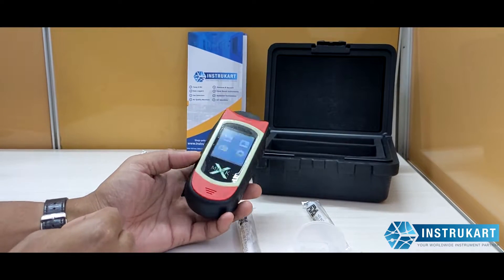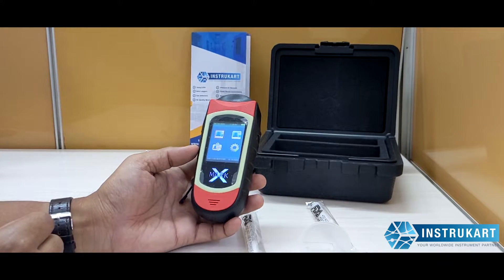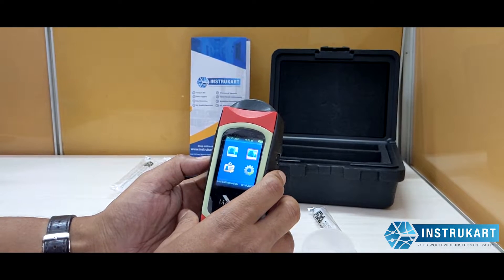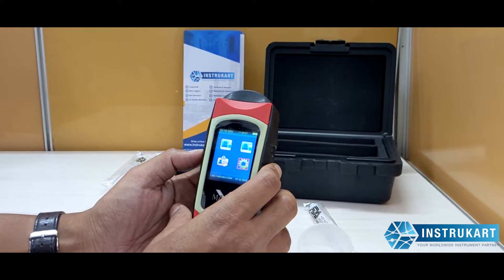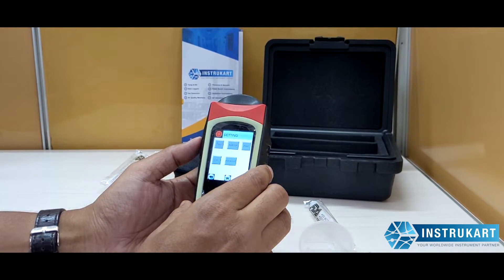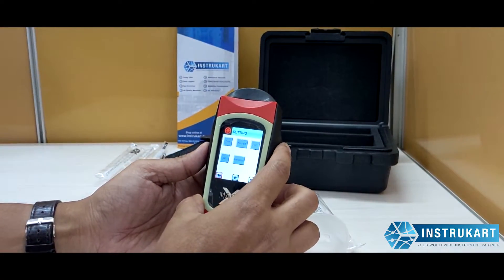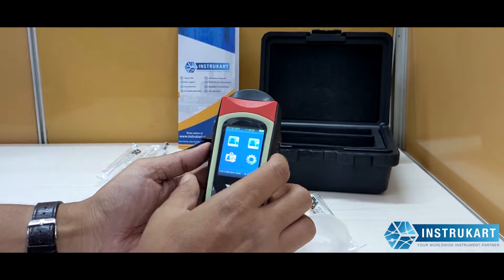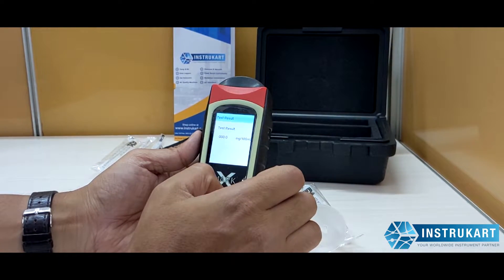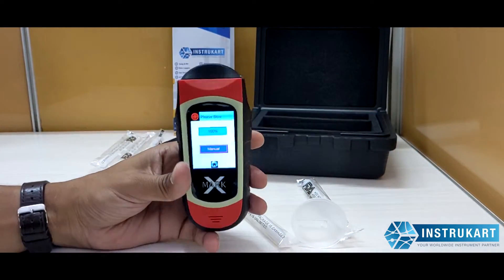The weight of this instrument is approximately 200 grams and the battery required is 7.4 volts. It can take up to 500 readings on a single charge. In the menu, there are calibration options as well as settings for time, auto off, print calibration, and advanced settings, and you can toggle between them.